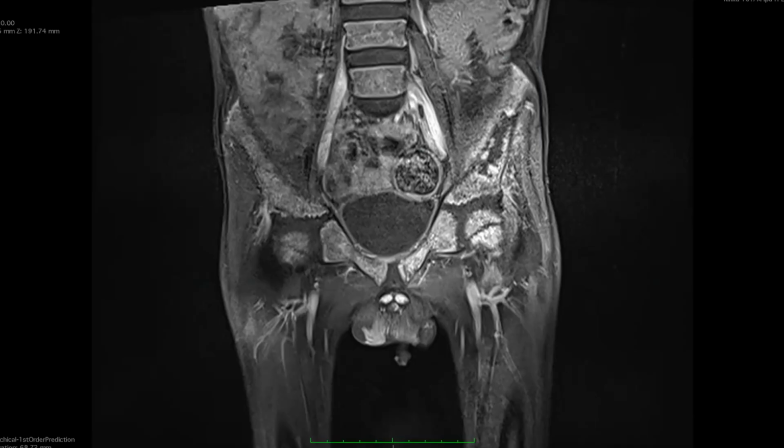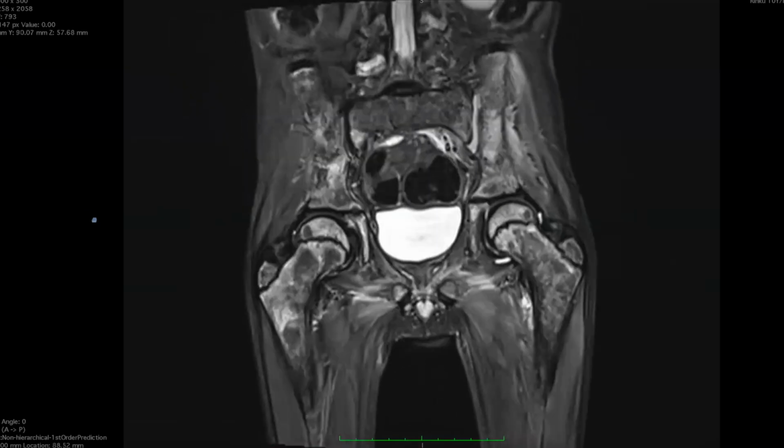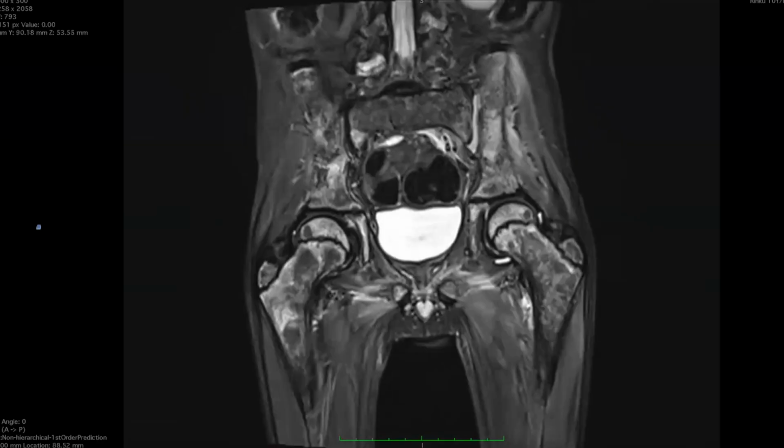All right. Thank you, Candidate E. Candidate E, very, very well presented. You picked up all the findings in the first look, and the examiners prefer if you form a list of differentials on the first sequence as well, which you very well did.